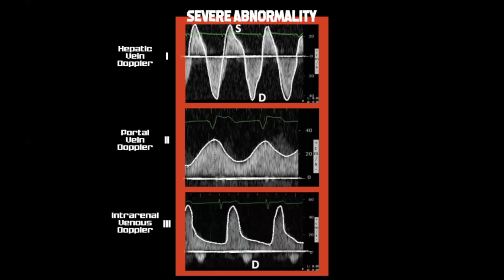But also looking at your renal venous flow, there will usually just be one peak left, and this we call monophasic flow, and it's a single peak just in diastole. Essentially, you're seeing systolic flow reversal of your renal venous flow. So your systolic wave is no longer below the baseline; it's actually above the baseline. So all you're seeing is a little diastolic peak below the baseline.